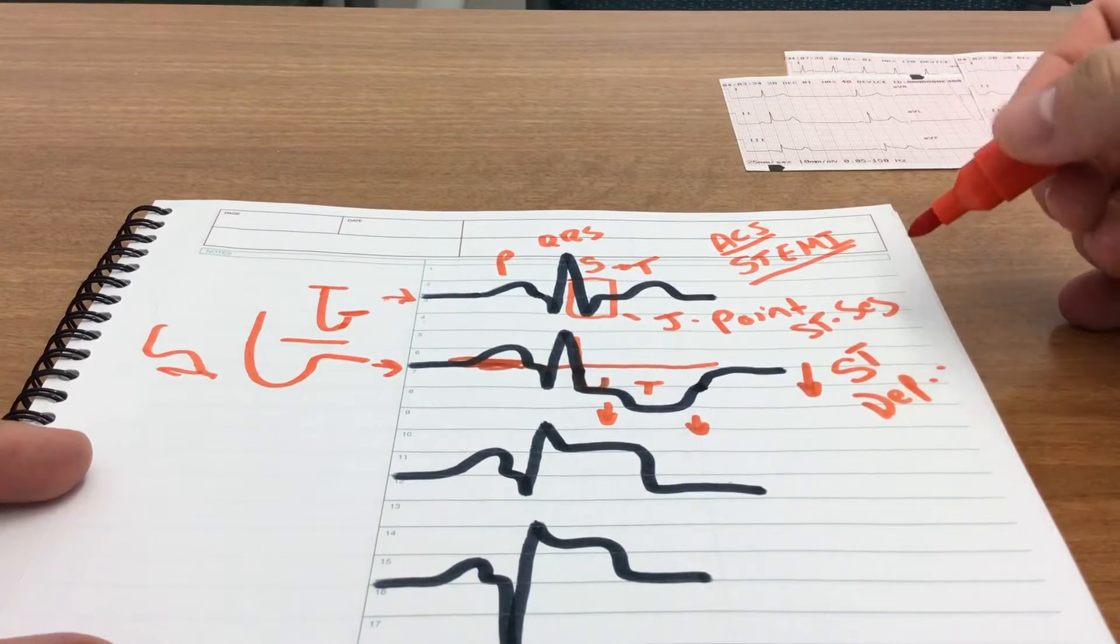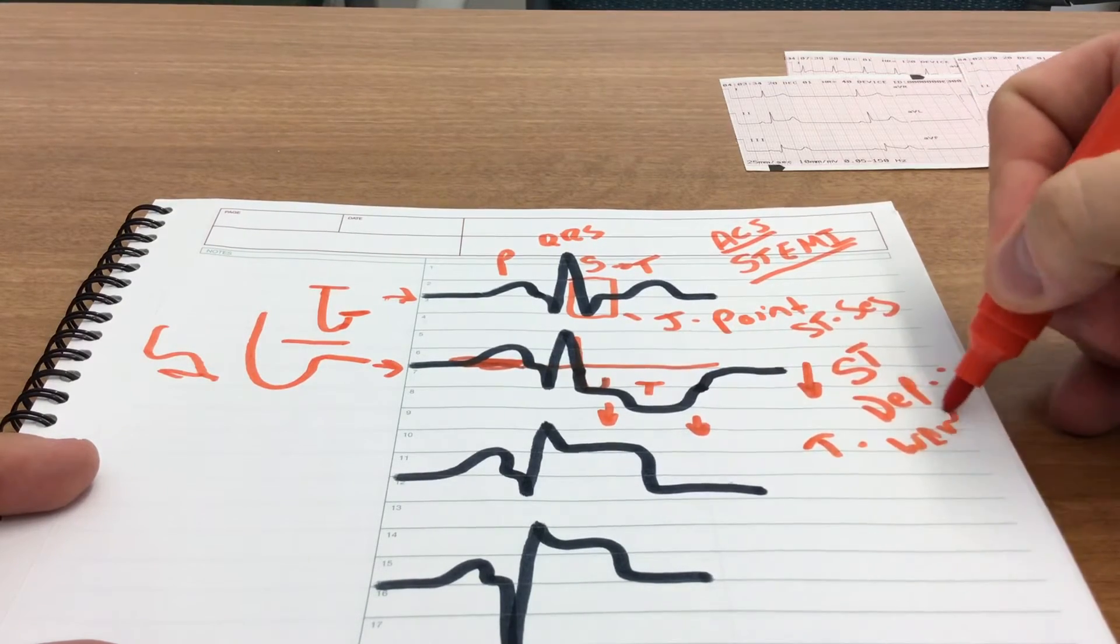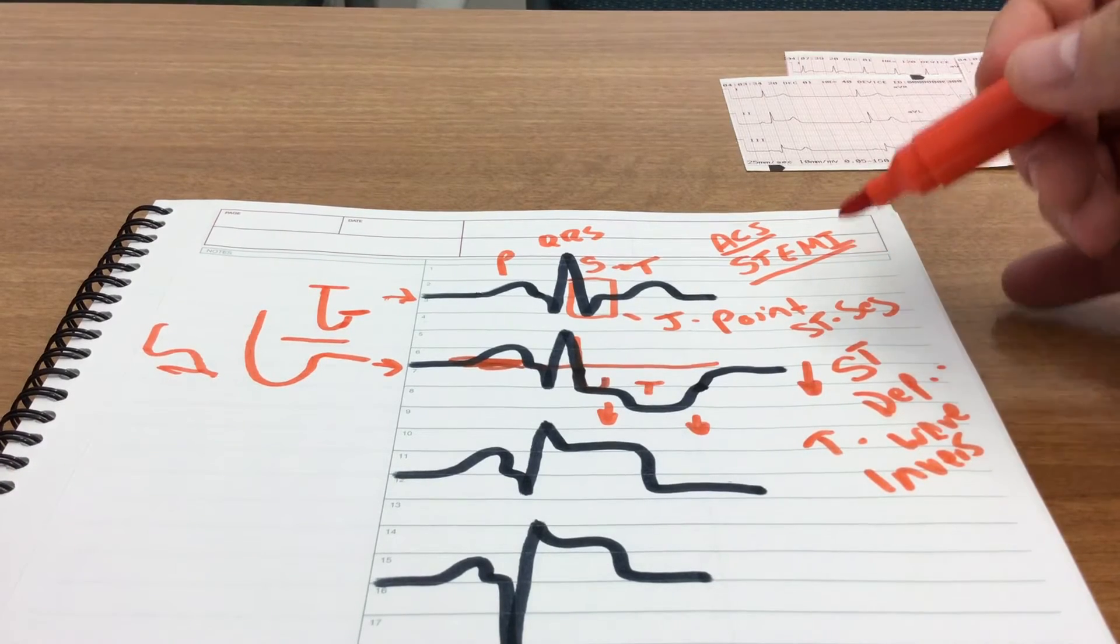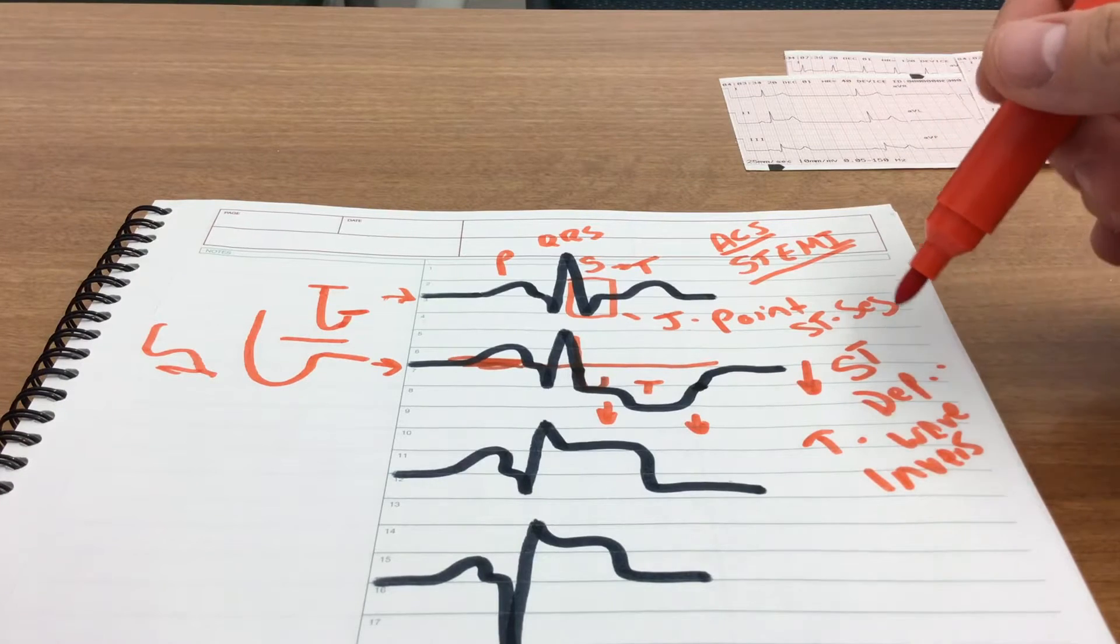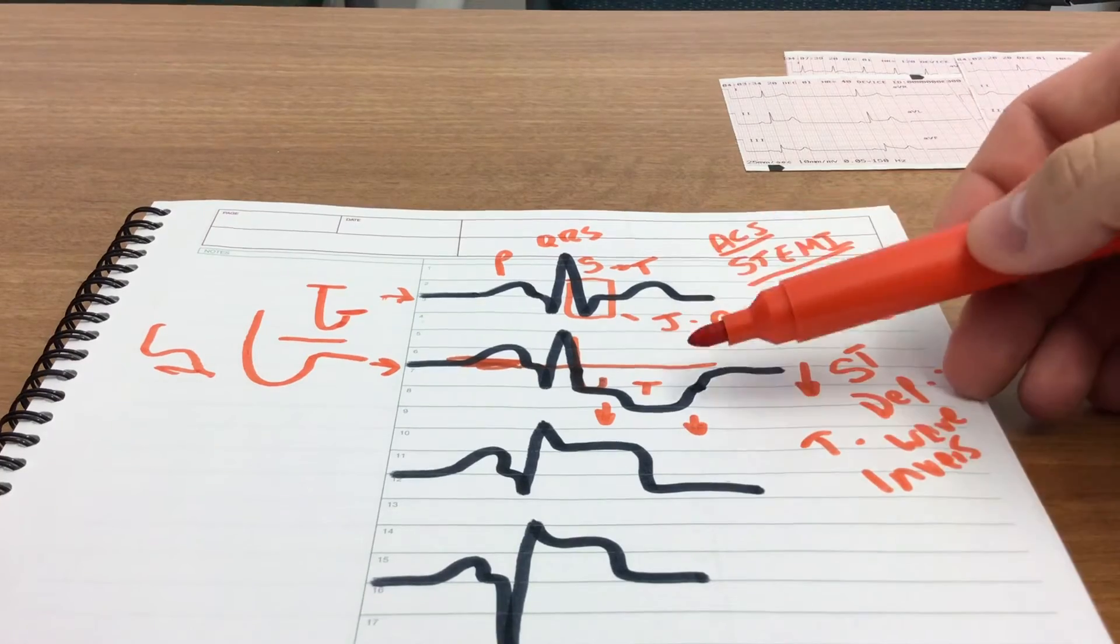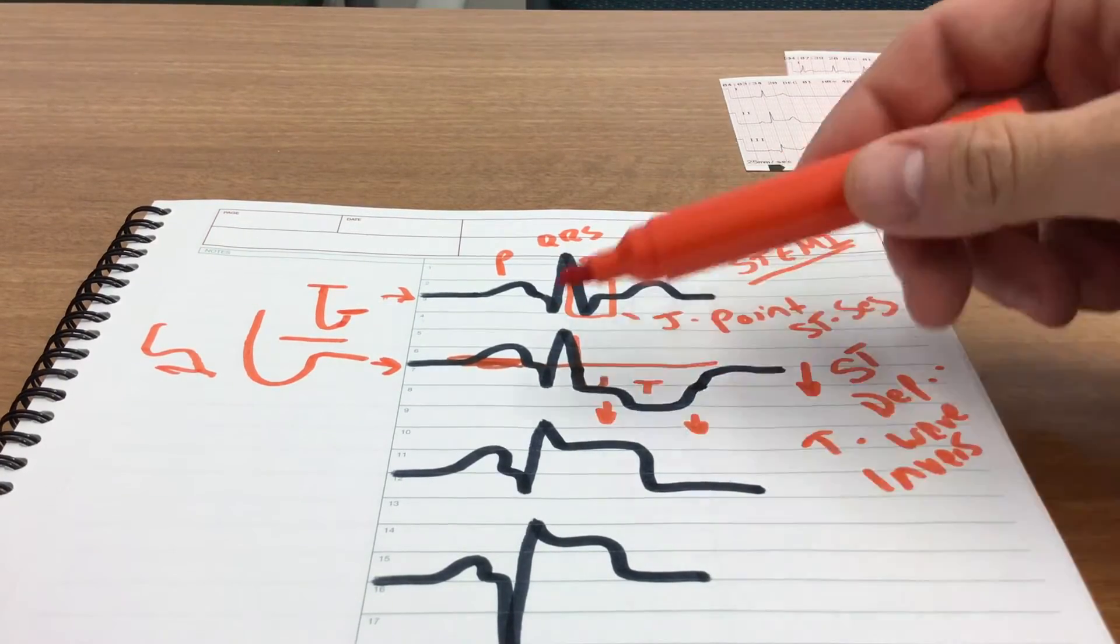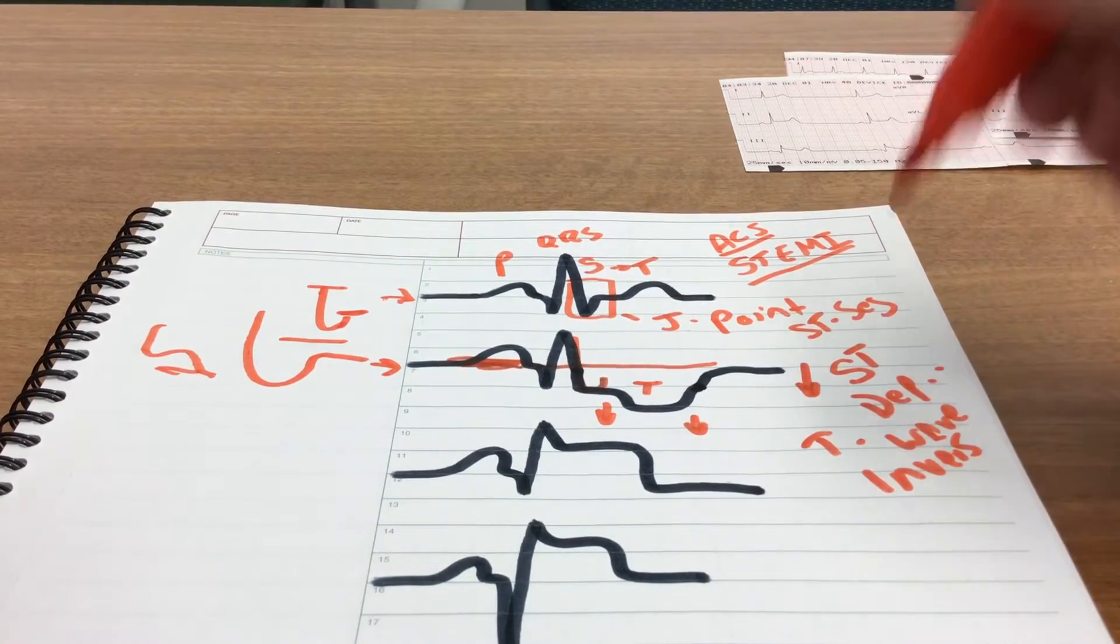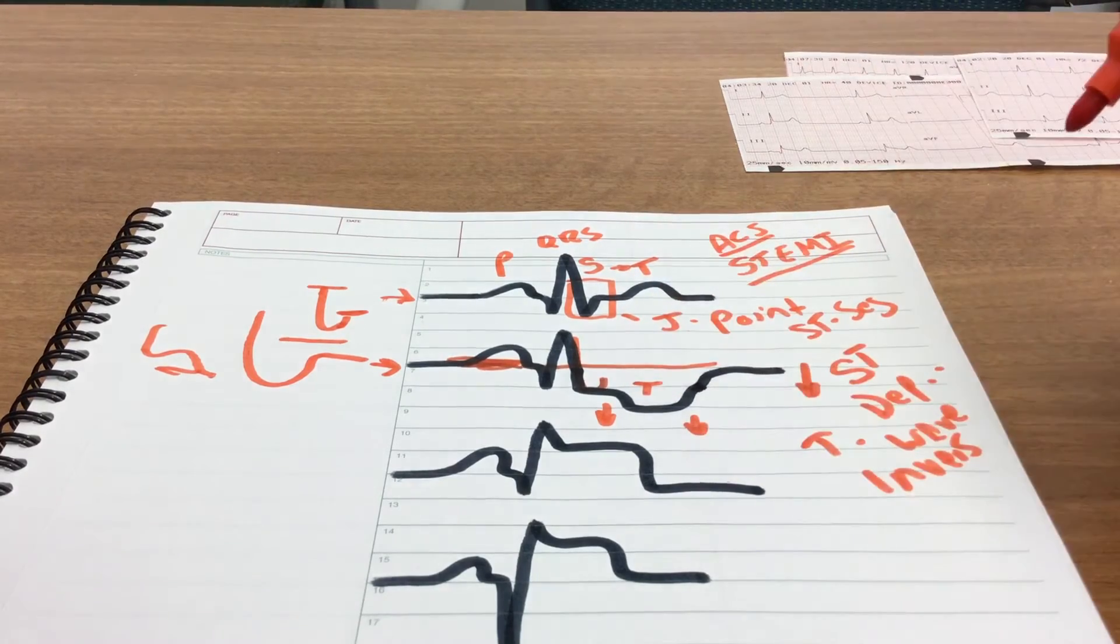ST segment depression, and you can even say T wave inversion here. The T waves are inverted, they're in the opposite direction. ST depression or T wave inversion is indicative in many cases of ischemia. So this is normal, this is an area of the heart that may be potentially ischemic, or it may point to a possible posterior wall STEMI if we see this in certain leads.